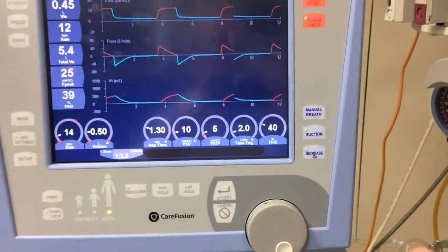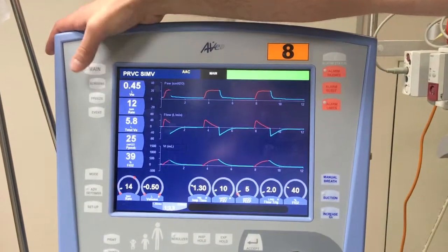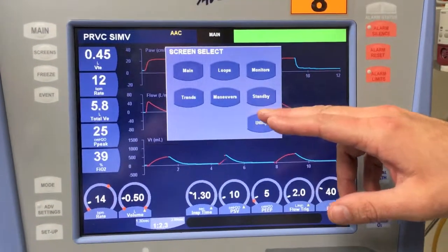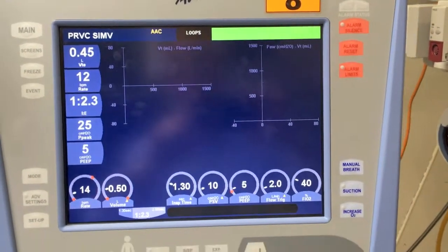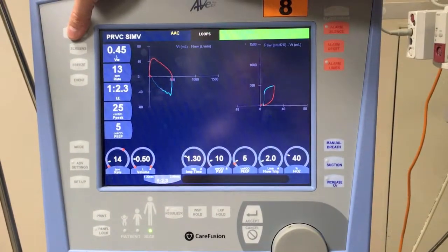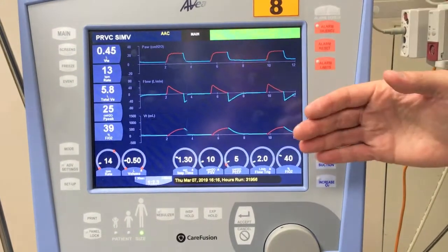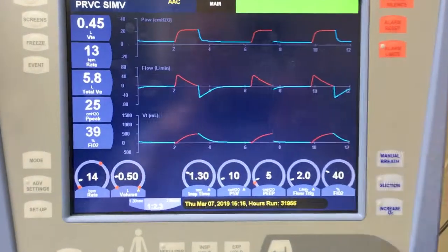Some of the useful and handy functions of this ventilator are being able to easily get into other screens, such as loops or standbys. Simply, just by touching a couple of buttons, you can easily change your screen. I'm just going to change back to the main screen now, where like most ventilators you get your three waveforms: pressure, flow, and volume.